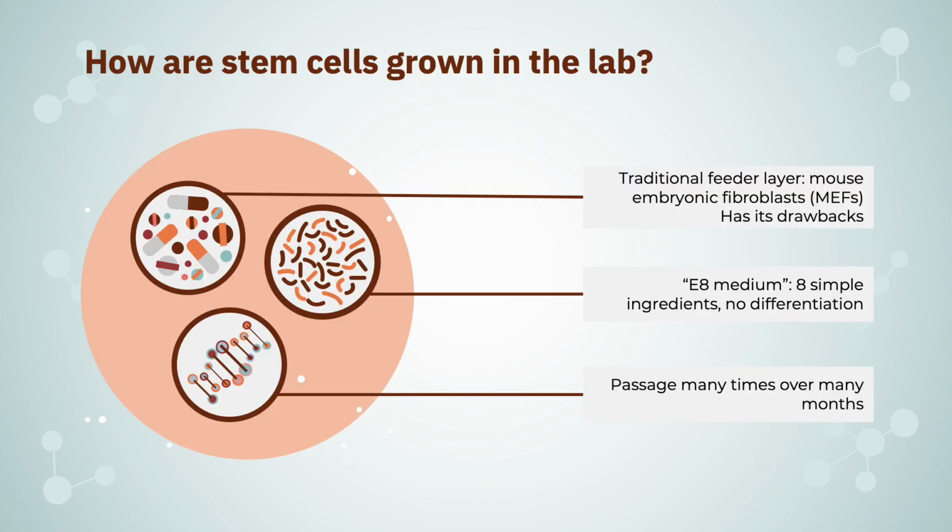So, how do we grow stem cells in the lab? Just like culturing any cell, we need culture medium or nutrient broth. Stem cells are incredibly fickle, and the slightest variation in culture media changes them. This means that the media needs to be optimized for growing different types of stem cells, and this media should be changed each day. Stem cells are grown on plastic culture dishes coated with extracellular matrix components such as gelatin, Matrigel, or collagen, or with a feeder layer to aid in attachment.